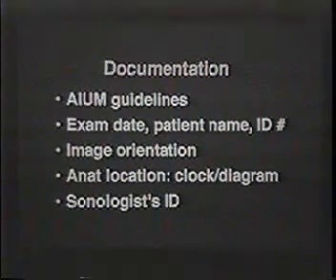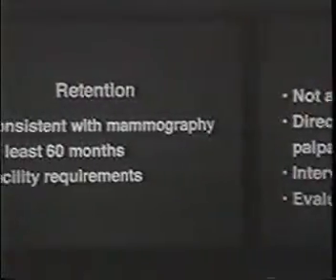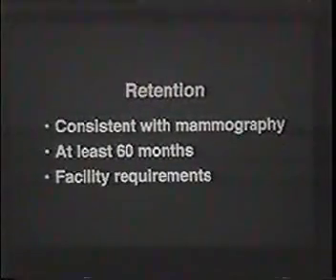The clock face, of course, is different for the right and left breast. In addition, the recommendation is that each examination should contain the sonologist's ID, whether it be technologist performing the examination or radiologist.